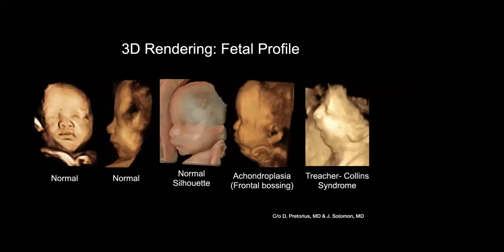Really helpful for us to identify, especially when you're assessing for any facial abnormalities, it helps us to align, right? If the face and skull can be aligned accurately in standard anatomical planes, enabling objective assessment for fetal symmetry or asymmetry in multiplanar or tomographic or render mode displays.